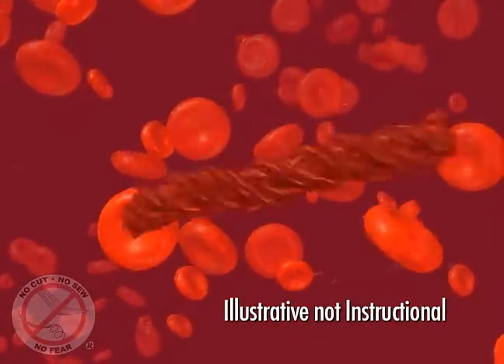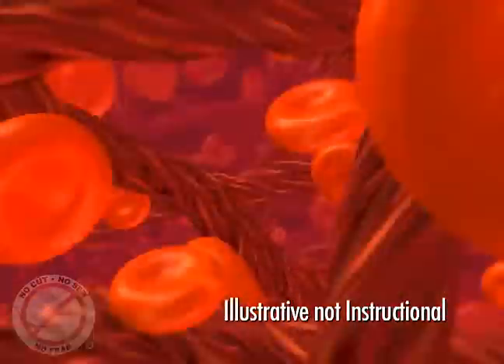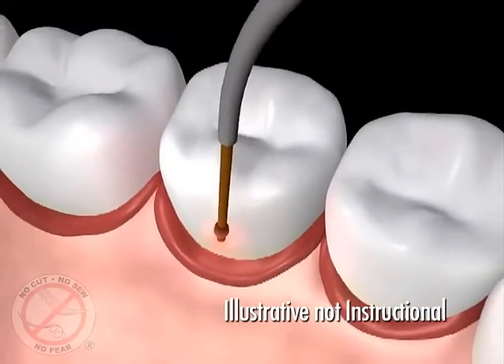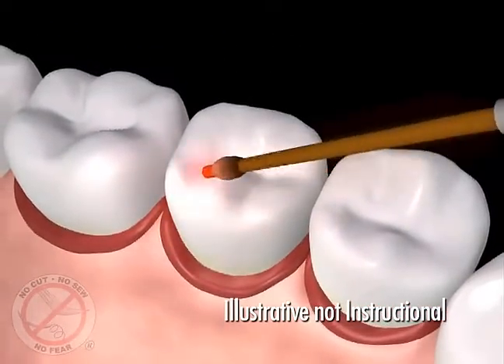This also causes the blood to become sticky, creating a seal around the teeth. Once the seal is formed, we have created a clean, closed, and stable environment for healing to begin.